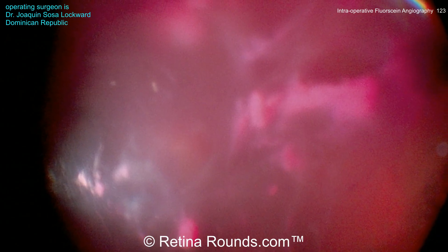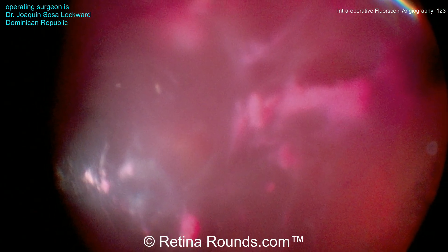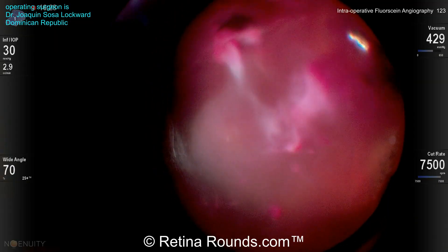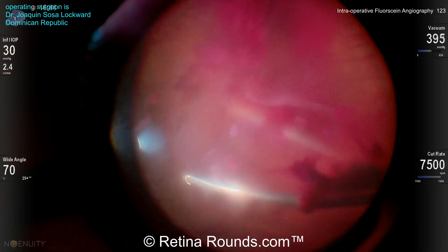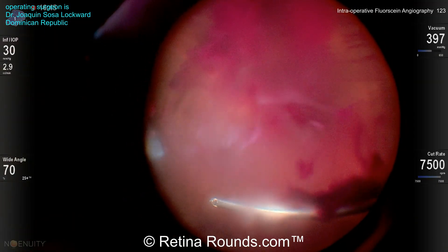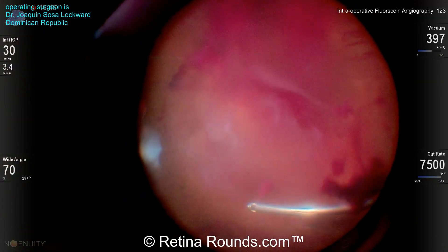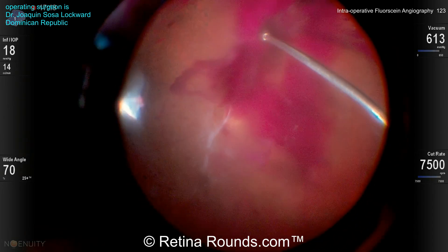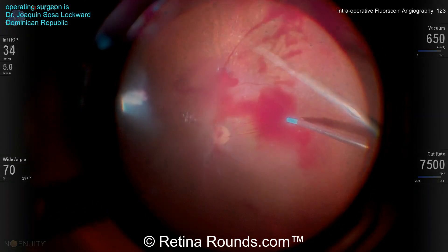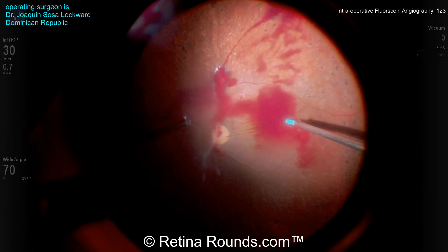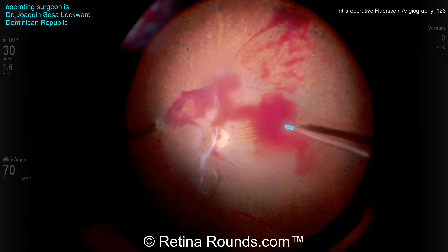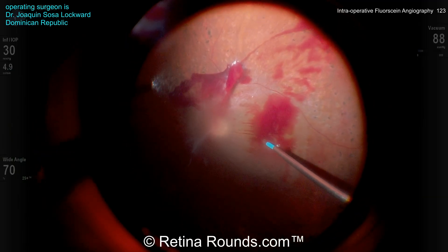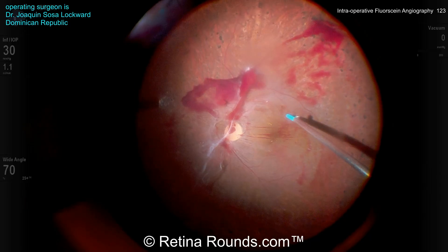This is a case of a 56-year-old diabetic male with long-standing vitreous hemorrhage and proliferative diabetic retinopathy. You can see here that Dr. Lockward is starting by performing a core vitrectomy to clear out the vitreous hemorrhage. And as that vitreous hemorrhage is cleared out, you can see that there are some areas of fibrovascular proliferation, particularly around the optic nerve.